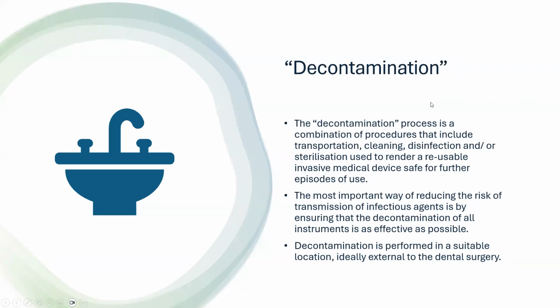What is decontamination? It is a combination of procedures that include transportation, cleaning, disinfection, and or sterilization used to render a reusable invasive medical device safe for further episodes of use. The most important way of reducing the risk of transmission of infectious agents is by ensuring that the decontamination of all instruments is as effective as possible. Decontamination is performed in a suitable location, ideally external to the dental surgery.